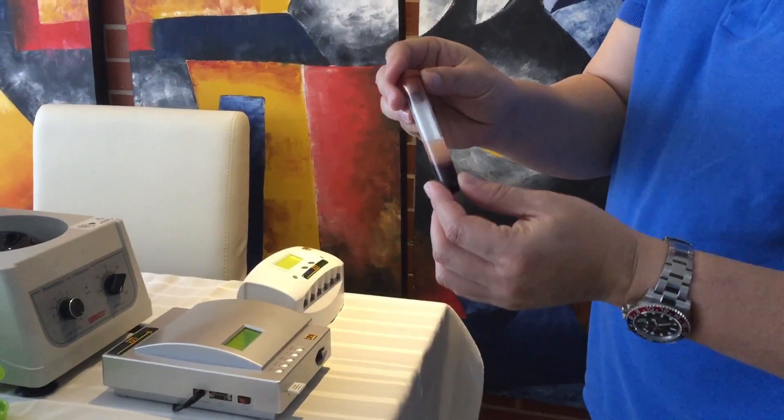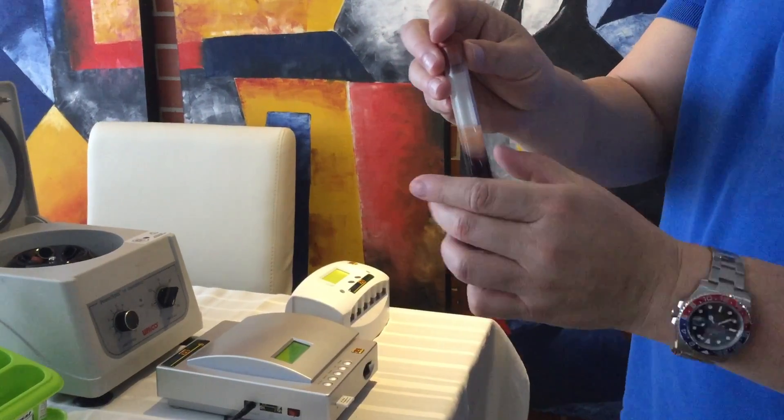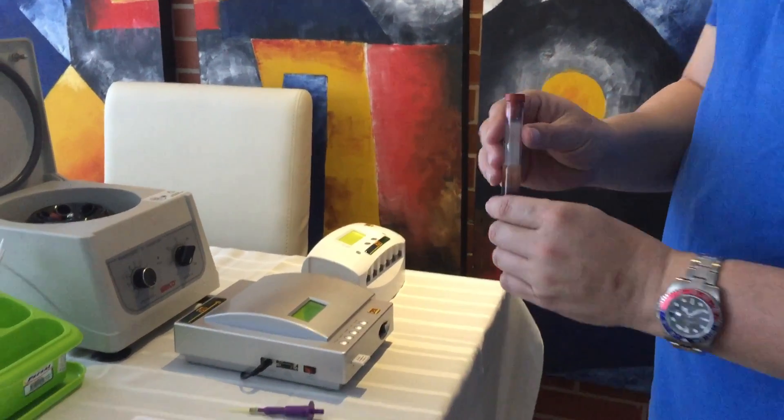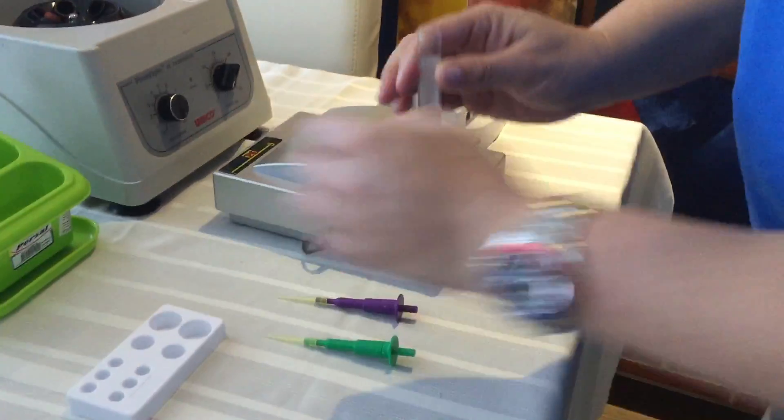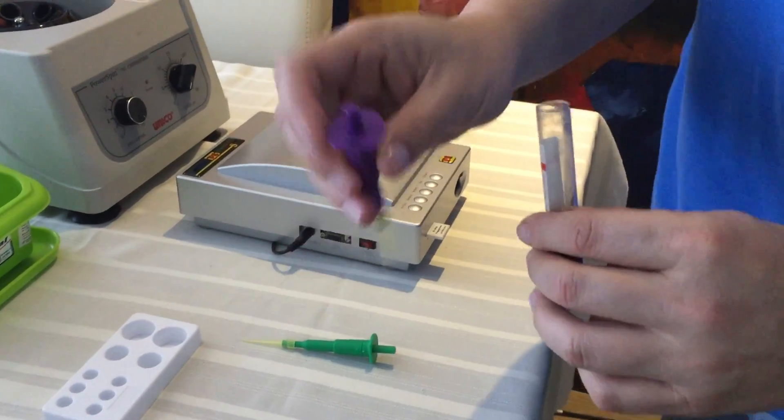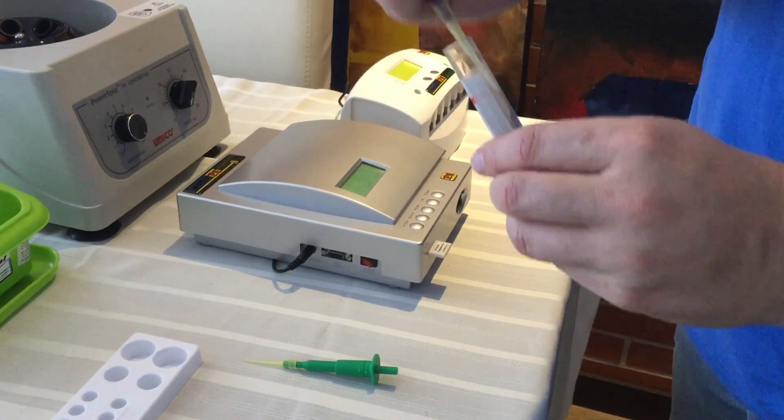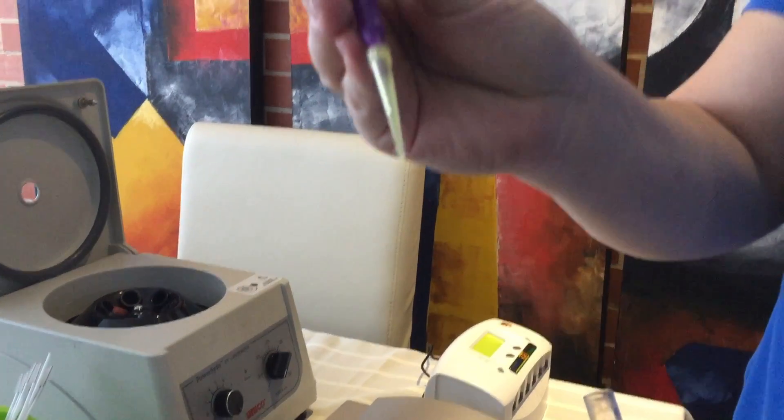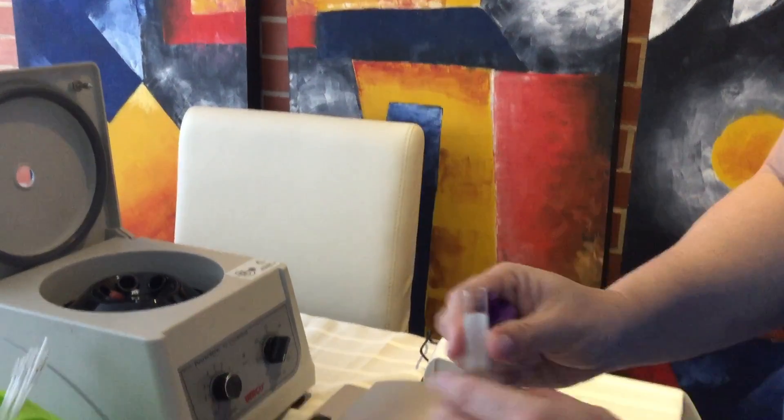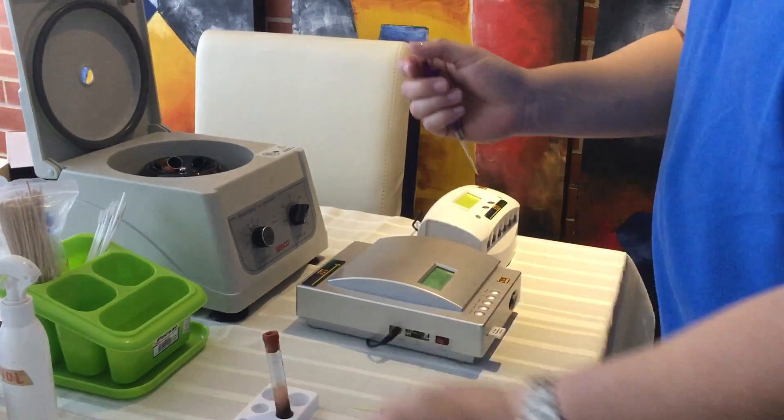So, we have the blood spun. You want to make sure it's nice and clear. And we're going to do the progesterone test right now and the P4 analyzer. And then we're going to get 30 microliters of serum. Make sure there's no bubbles. Yesterday she was at 1.48 nanograms.